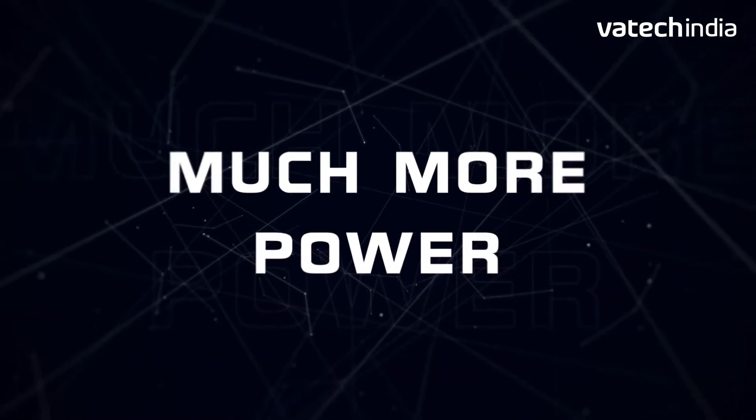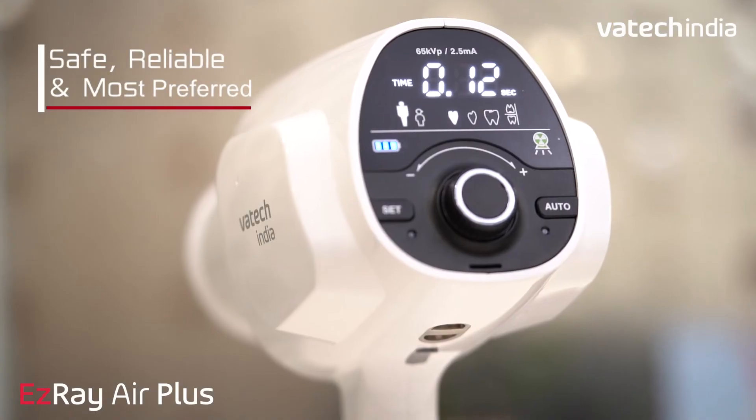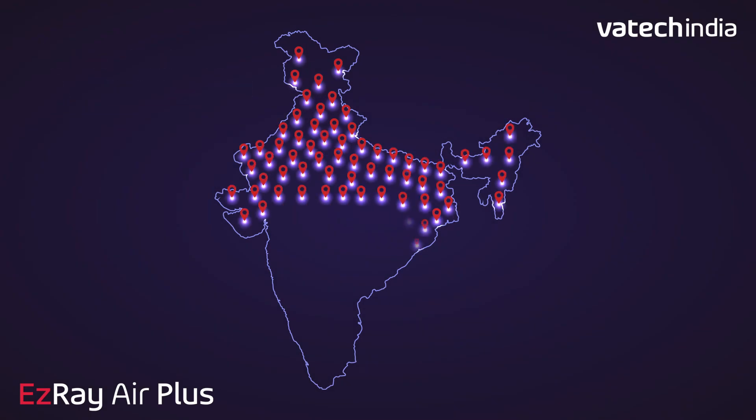With much more power, much more innovation and technology, EZ-Ray Air Plus is more safe, more reliable and the most preferred smart unit for your dental practice.